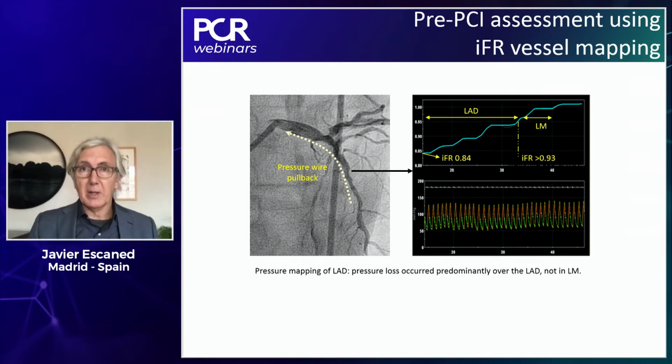Hyperemia amplifies a lot the turbulence and provides much more signal-to-noise ratio, so to speak, to the distal stenosis than the proximal one. And that is one of the beauties, and there are many publications addressing this value of non-hyperemic pressure pullbacks as better tools, perhaps, to predict the final result when you treat a specific segment of the vessel. So that would be my recommendation at this particular point.